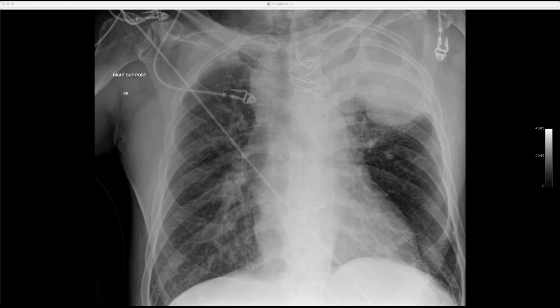It's also the case that in recent years, multi-detector row CT, with its increased spatial and contrast resolution, shows it's not uncommon to have communication of opacified blood from the lumen to the wall of the aorta. And I think there's accumulating evidence that the so-called primary vasa vasorum theory is probably not operable.